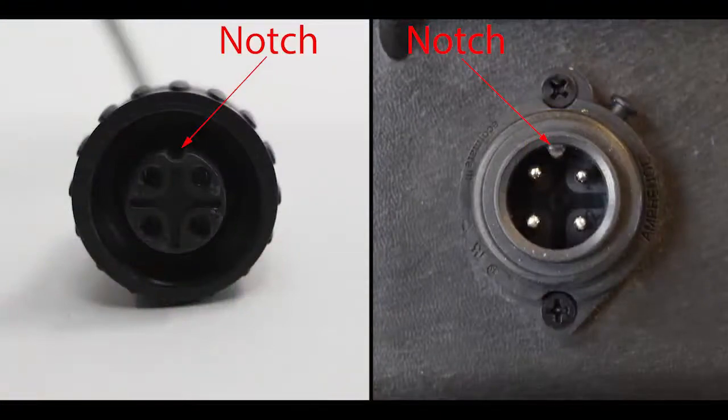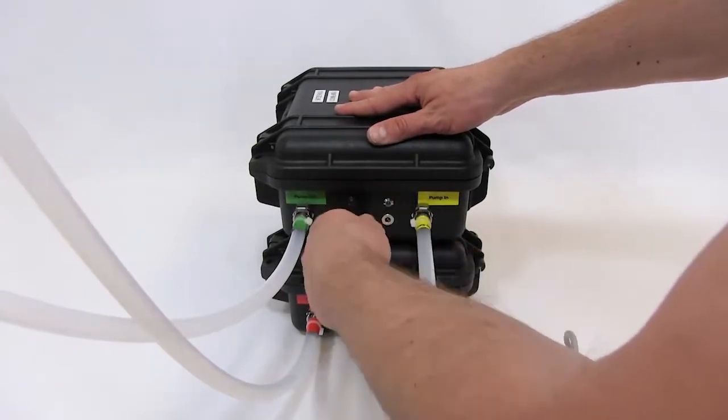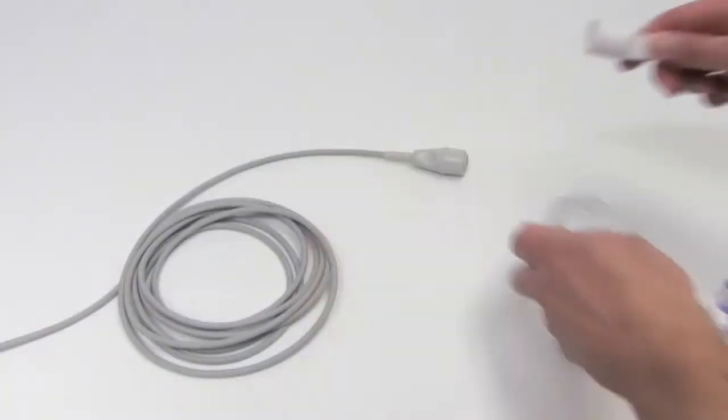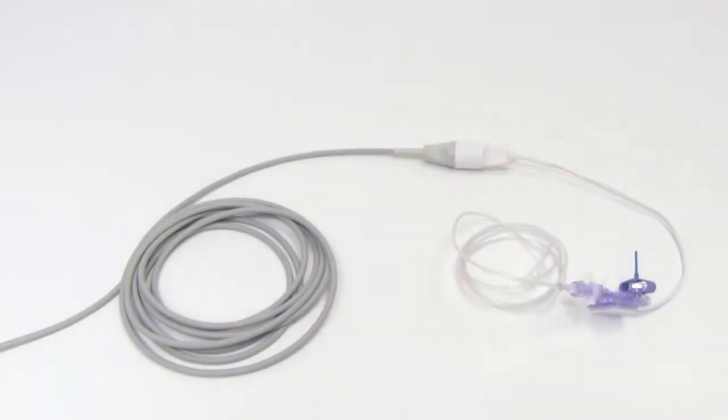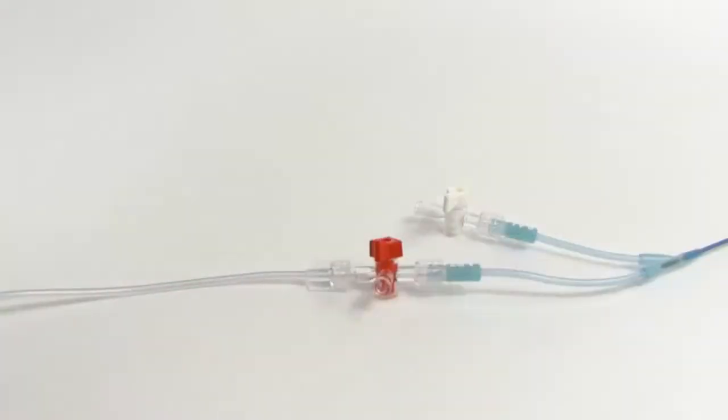Connect the blood pressure monitoring cable to the pump, ensuring the notch in the plug lines up with the notch in the socket. Plug a blood pressure monitoring transducer into the cable. Attach the blood pressure monitoring transducer extension line into the REBOA catheter's art line.